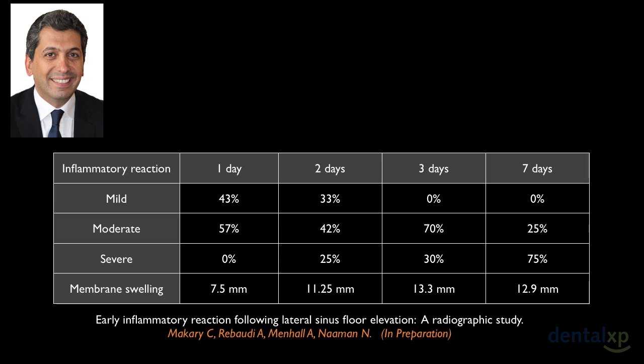For another group of patients, it was done at 2 days. For a third group, it was done at 3 days. And for the fourth group, it was done at 7 days. Surely, each patient received 1 radiograph. We did not do the whole radiograph series for the same patients. It was divided in 4 groups.